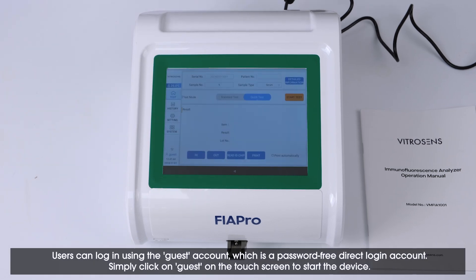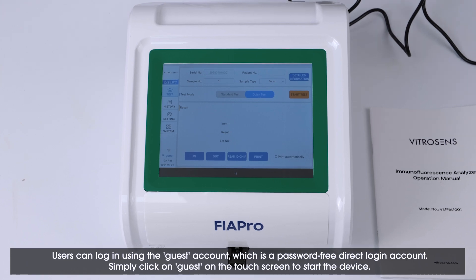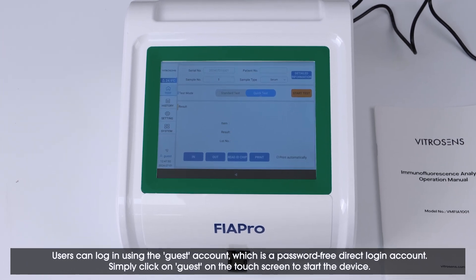Users can log in using the Guest account, which is a password-free direct login account. Simply click on Guest on the touch screen to start the device.